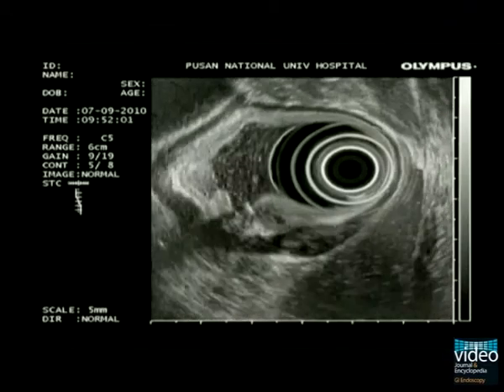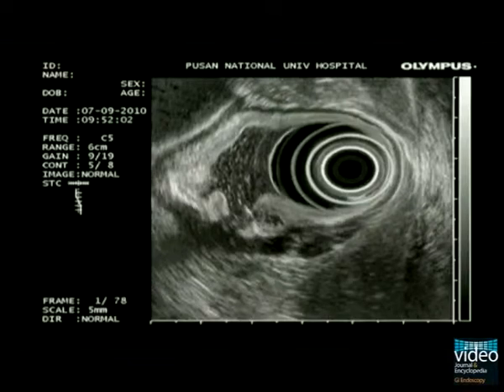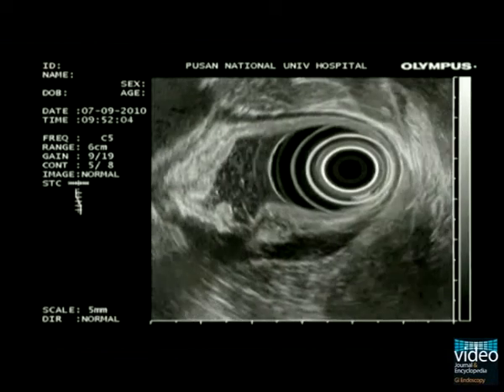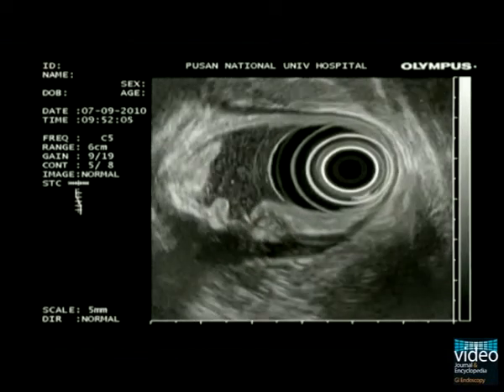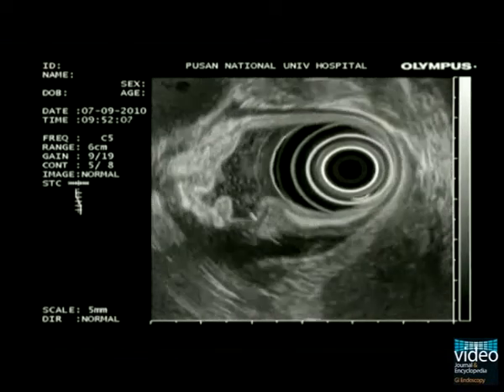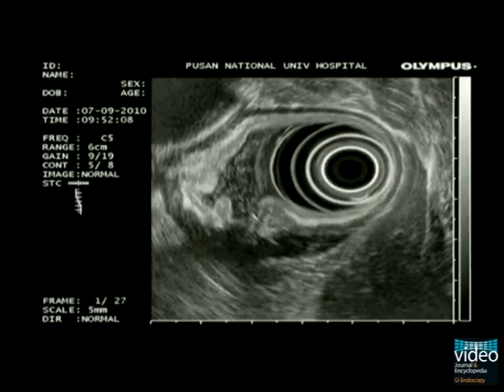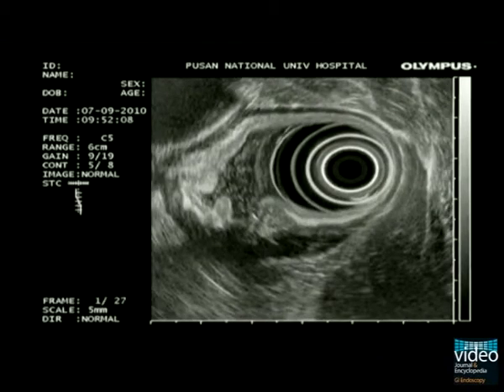This is an EUS finding for another deep-type ectopic pancreas in the antrum. In addition to the findings mentioned previously, a definite duct-like structure can be clearly seen.